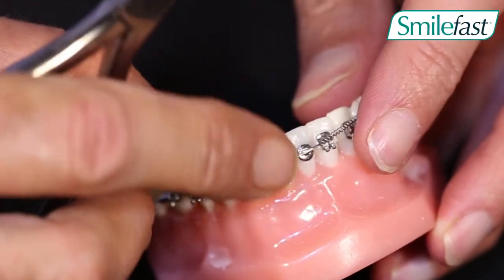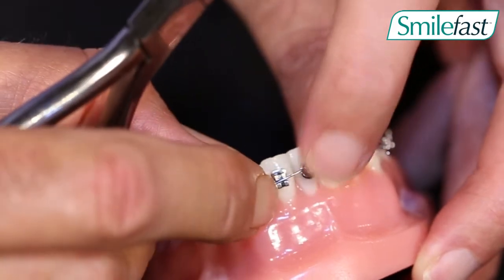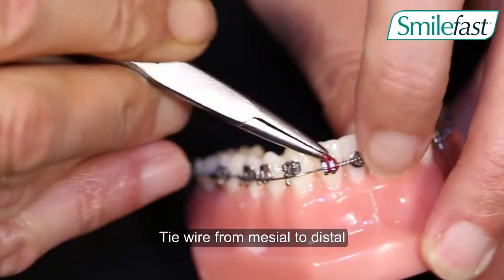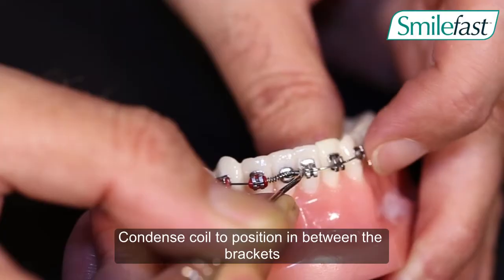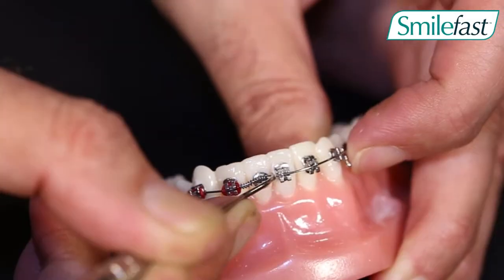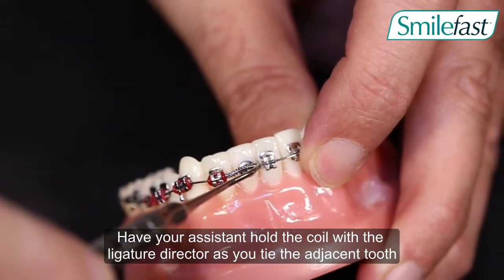Thread the wire through so it is sitting in all the brackets. Then we go ahead and tie the arch wire in with elastics or ligatures. Then we need to compress that open coil spring so it sits between the two brackets that we are attempting to open the space on.